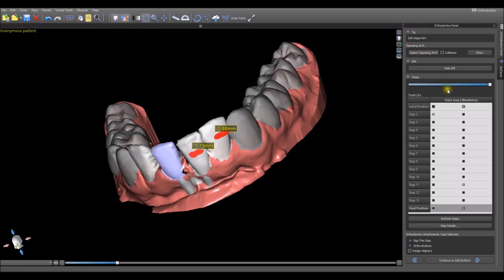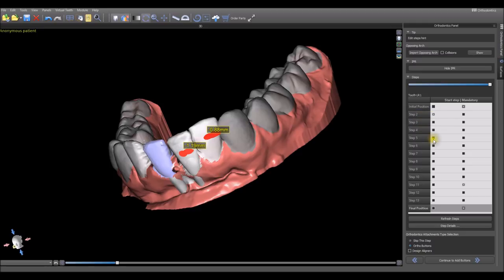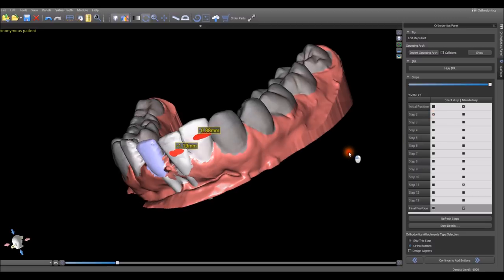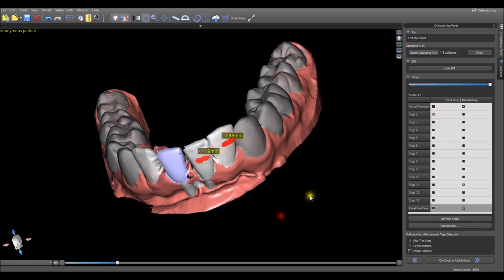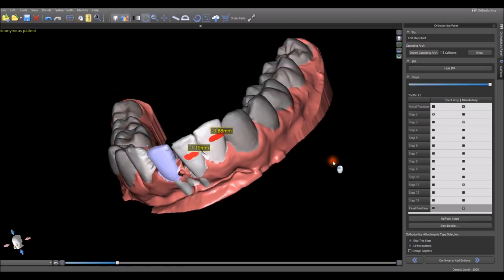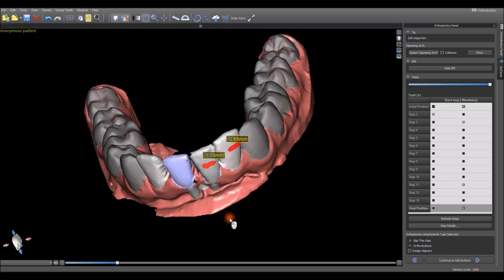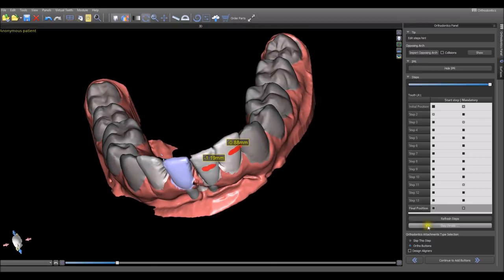The first column that appears here, called start step, allows us to indicate for any given tooth that we click on what should be the start step for that particular tooth. Now we're looking at tooth LR1 starting in step 2. If we want to change it, we can click on the relevant step. We can also force the tooth to move at a particular step by adding X marks to the checkboxes. For tooth LR1, we're forcing it to move at steps 3, 4, or 5. Once we make these changes, this might affect the calculations, so we click the refresh steps button.